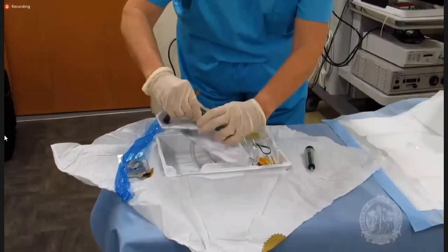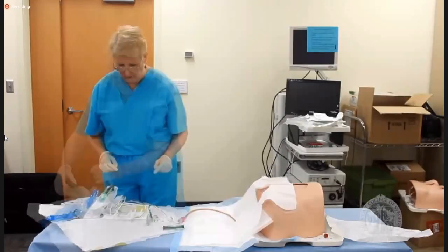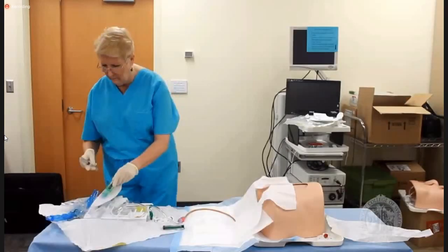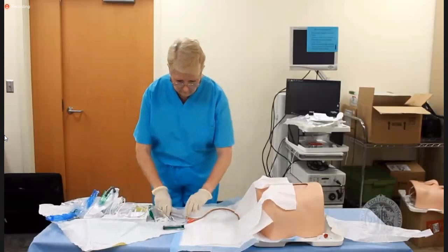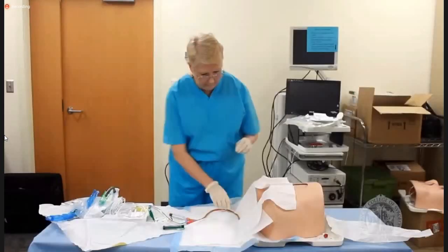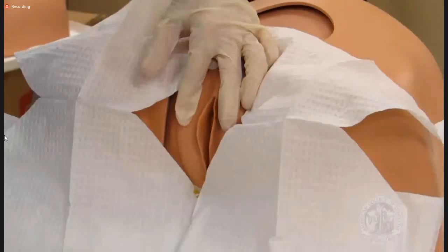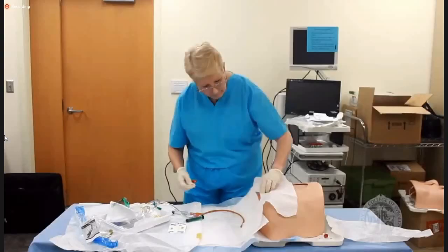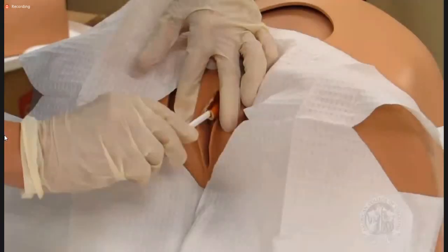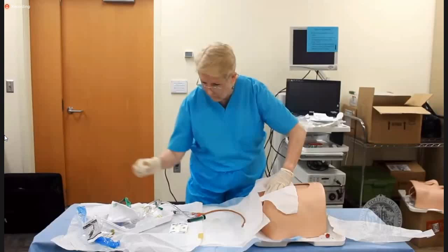Place the tip of the catheter in the lubricant. Attach the sterile water to the port on the catheter. Though it used to be commonplace to check the balloon, the manufacturer and most institutions no longer recommend this step. You will use your dominant hand to hold and place the catheter. If you're using your left hand to place the catheter, stand on the patient's left side. Spread the labia majora and minora apart with your non-dominant hand, exposing their urethral opening.